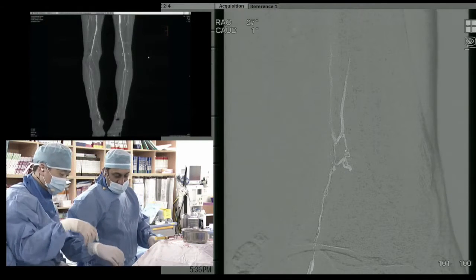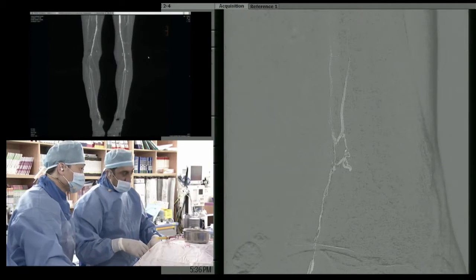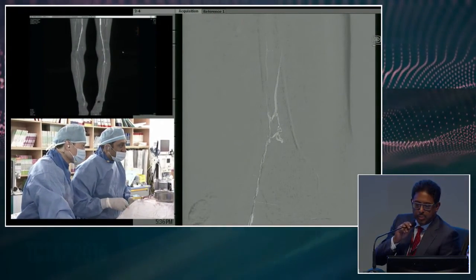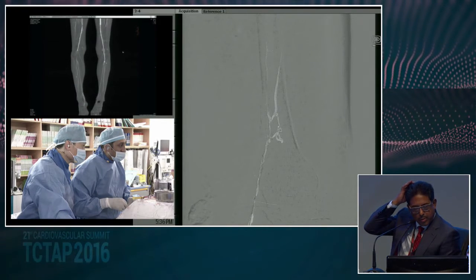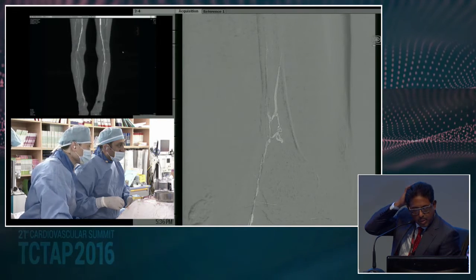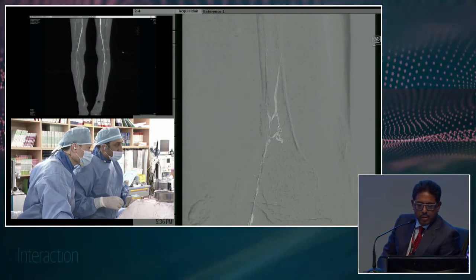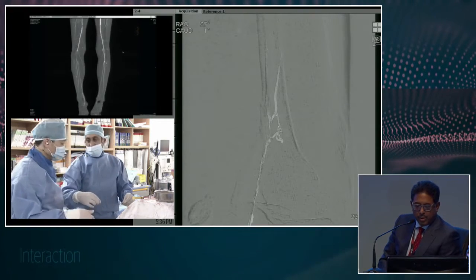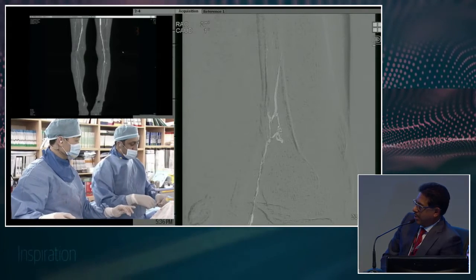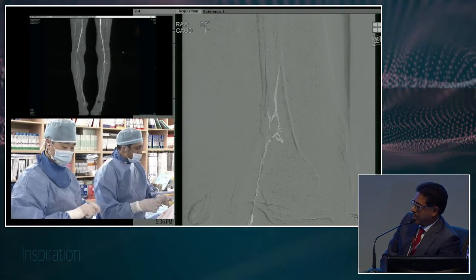I'm sorry, I missed the initial presentation. Is this an antegrade stick? This is an antegrade stick, that's right. I think that's an important point to start with. Planning for success, obviously you lose a fair amount of torqueability coming from the contralateral, which just complicates everything. And then to Lawrence's observation, your first pass is many times your marker of success or failure, or how long you're going to be in this procedure, particularly when you take a lubricious wire and it goes subintimally.